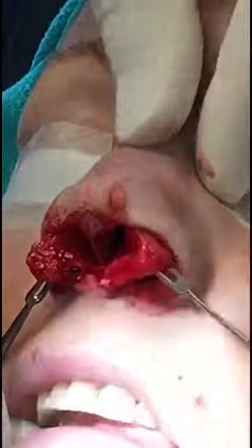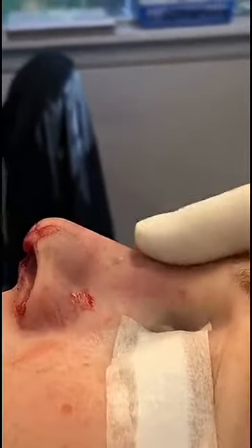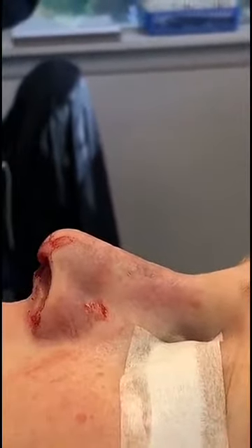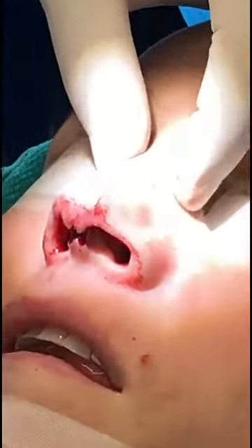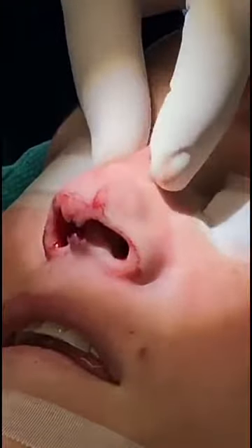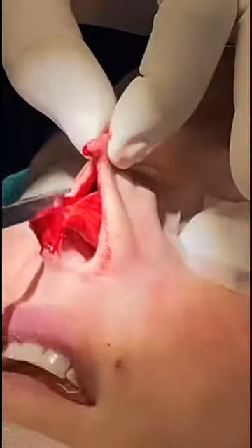A little bit of bone on that. So we're taking it down — you can see the bridge looks a lot better. We're going to continue to fine tune it as we work on the tip. But now we're going to work on the crookedness of the nose. The bones are going towards the left, and the cartilage is kind of snapping back to the right. So we're going to try to shift the nasal bones first.